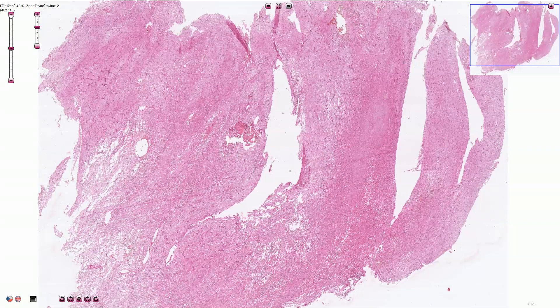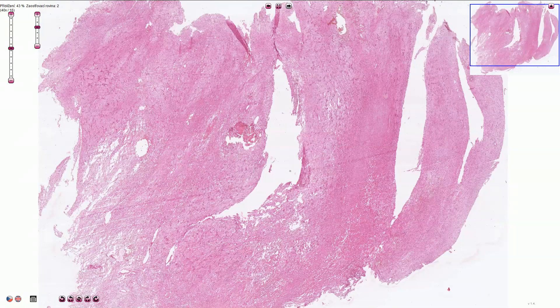Schwannoma is a typically encapsulated benign peripheral nerve sheath tumor composed predominantly of Schwann cells. Another name for this tumor is neurilemmoma. The tumor typically occurs in the superficial soft tissues and can be found in the head and neck area and also in the upper and lower extremities, but less commonly it can be found almost anywhere.